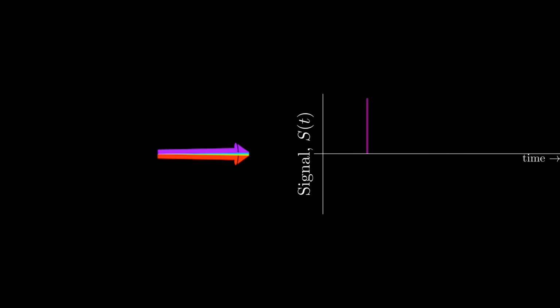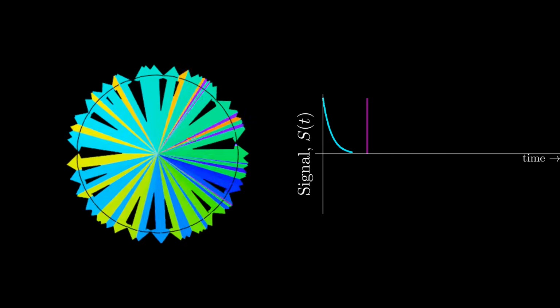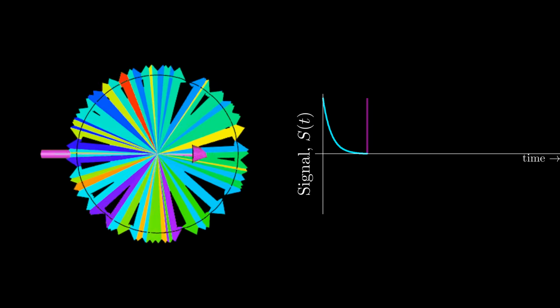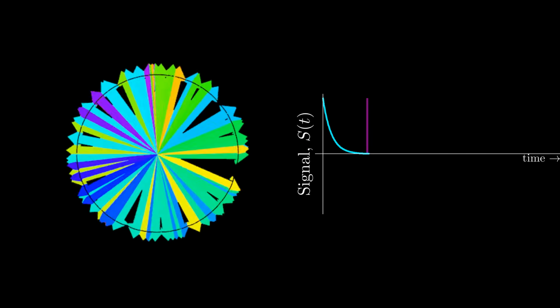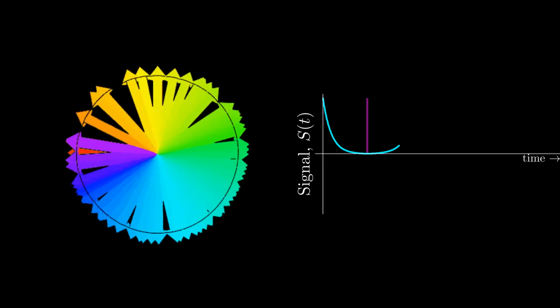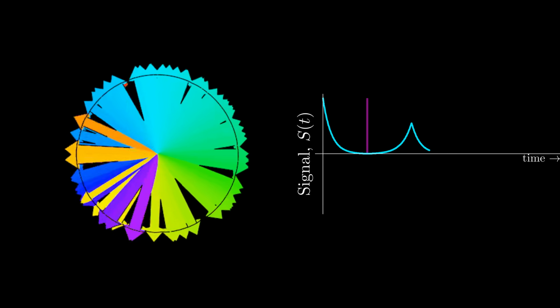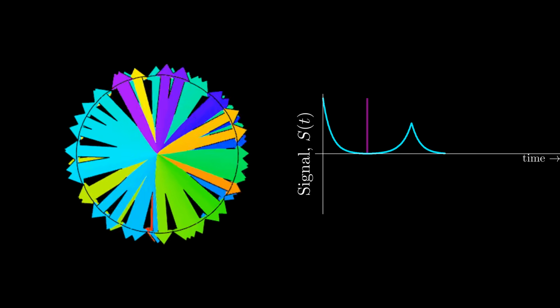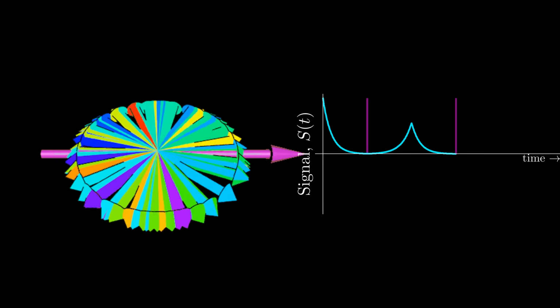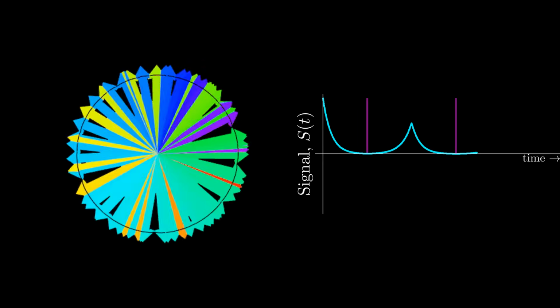The B0 field is coming out of the screen here, and I'll add our signal plot for us to follow. Remember that the spin colors represent their associated external field strengths. Red is in a high field, purple in a low field. Notice what the 180-degree pulse does to our dephased spins. After they're rotated 180 degrees, their precession continues, but they eventually rephase with each other. We can deliver another 180 if you'd like. The result is another echo.